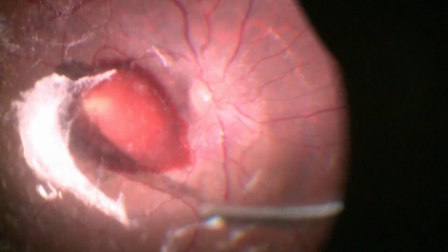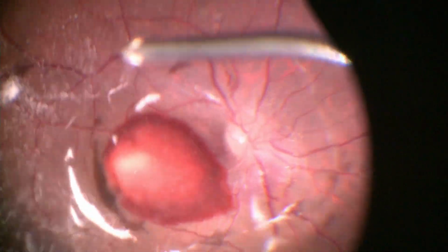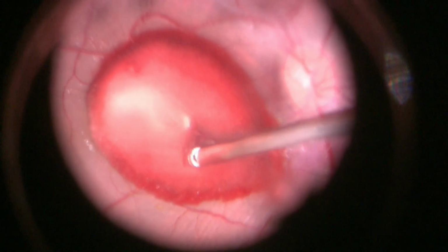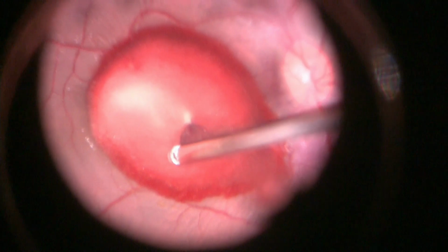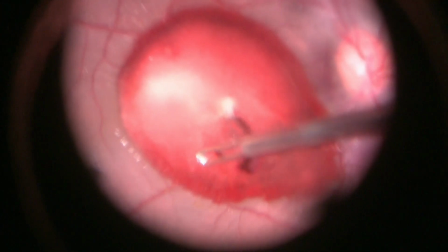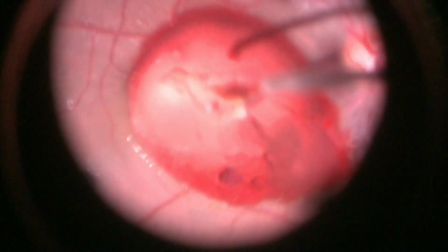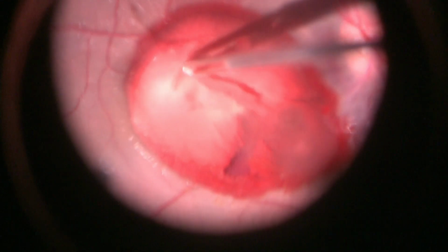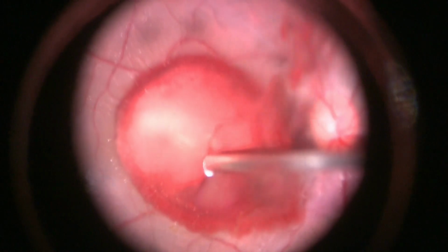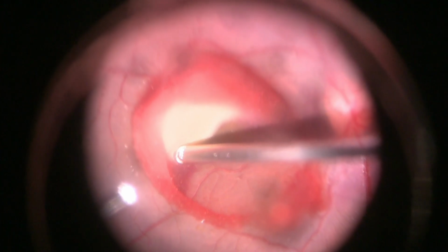This is yet another case where removal of the hyaloid did not expose the pre-retinal blood. While aspirating the surface with the cutter, there was a small breach in the ILM through which some blood oozed out. A forceps was used to totally peel the ILM all around the area of hemorrhage. Once exposed, the hemorrhage was gradually aspirated.